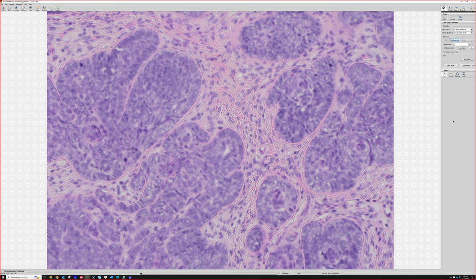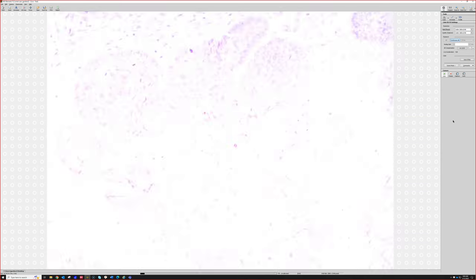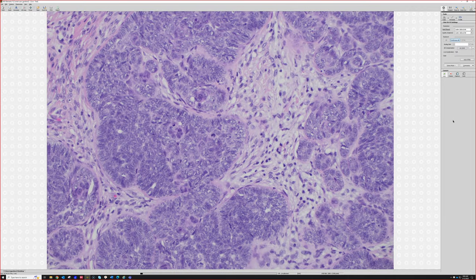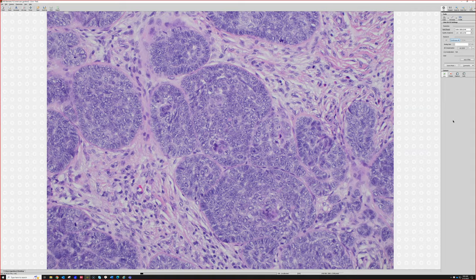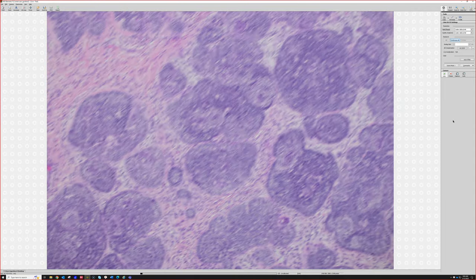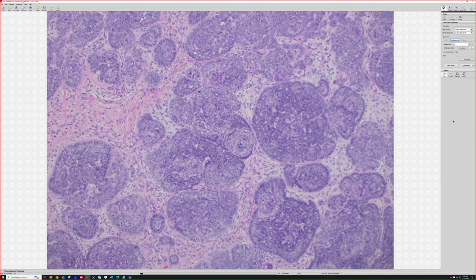Okay, then you can look closer. Now, this one actually had a decent bit of mitotic activity scattered in here, but I just didn't think there was enough atypia to make it something more exotic, like a trichoblastic carcinoma. There are such things, and there is debate over how to identify them. But to me, this was in the range of a benign hair follicle tumor. Somebody might say there are too many mitoses, it's atypical or whatever. But in any case, you can go read up more on that. There's a lot of controversy about those things.